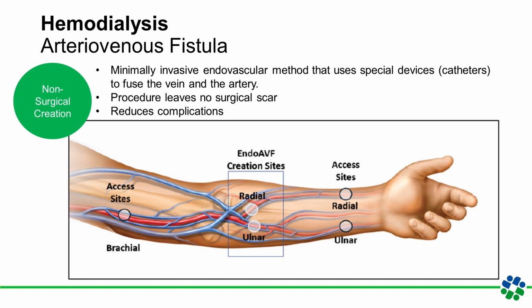And the second device, the WavelinQ EndoAVF system created by BD, uses a dual magnetic catheter system to align the artery and vein, and then a small burst of radiofrequency energy to create the fistula, again via two needle sticks. Now, these two minimally invasive procedures have revolutionized the creation of AV fistulas, typically resulting in a shorter recovery and fewer complications than traditional surgery.